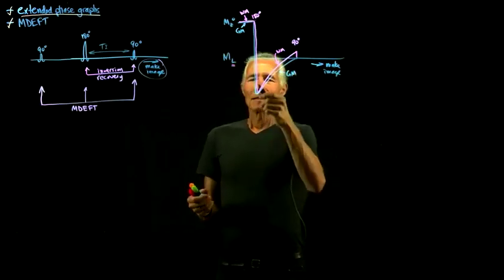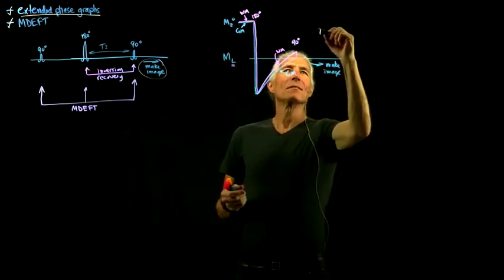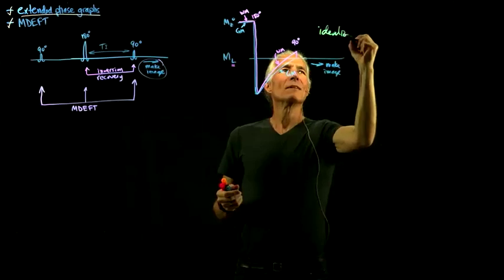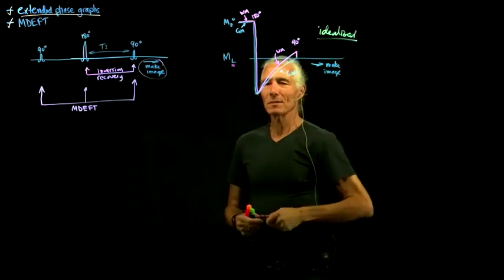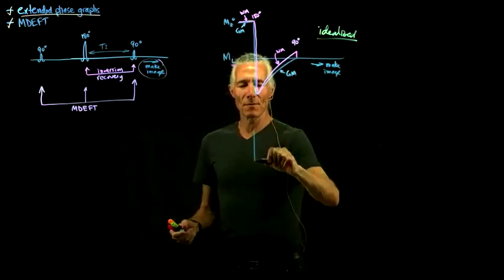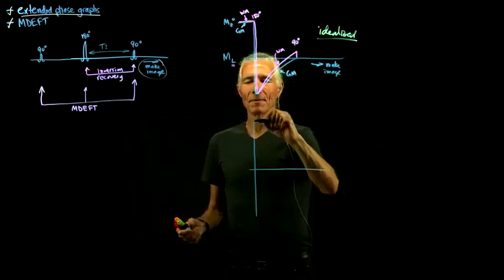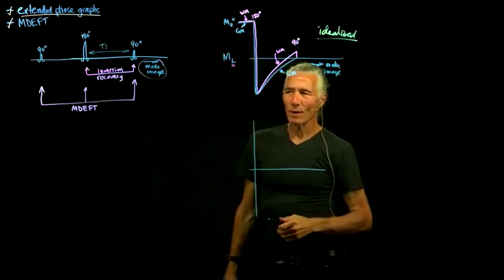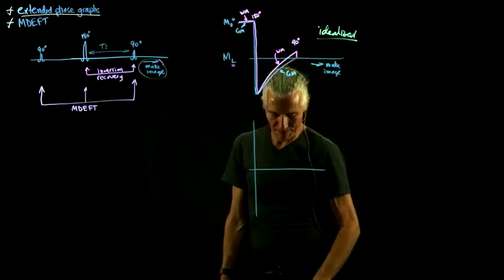This was the idealized situation, but what if we happen to start up another pulse before all the difference between the gray and the white matter went away, because we're trying to collect data faster, and we're always trying to collect data faster.